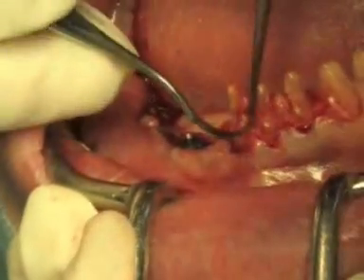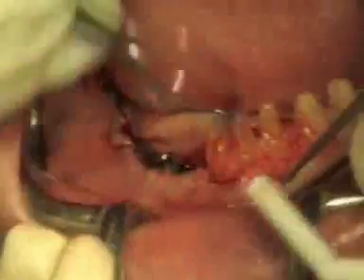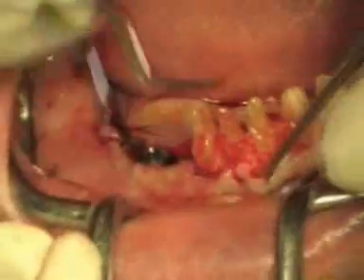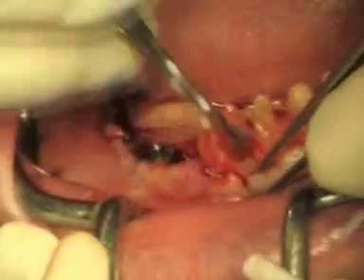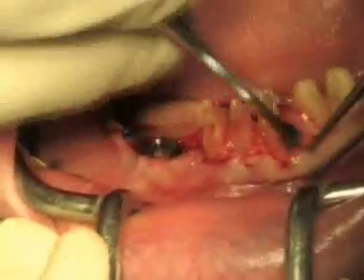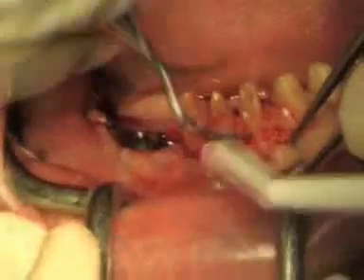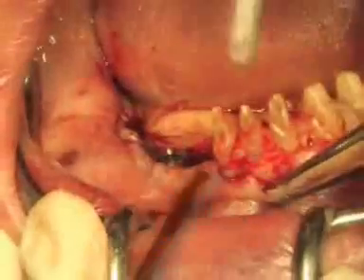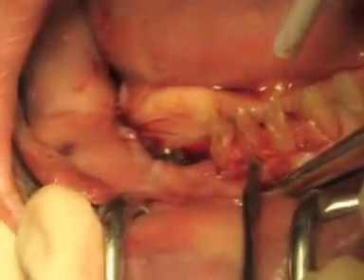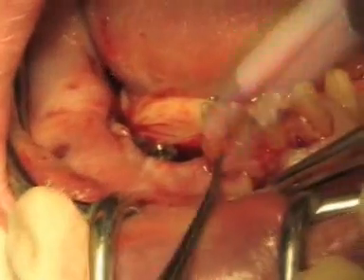At this point the bone level is also compensated through the correct position of the flap by means of apically stabilizing sliding periosteum anchor sutures at the level of the teeth. The flap is positioned apically. The opposite occurs at the level of the implants where, with coronally sliding flap sutures, it will be positioned coronally.